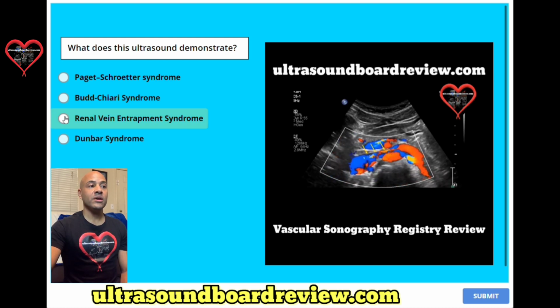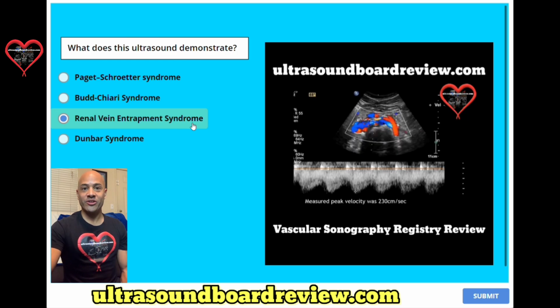The answer is C, renal vein entrapment syndrome, also known as nutcracker syndrome.